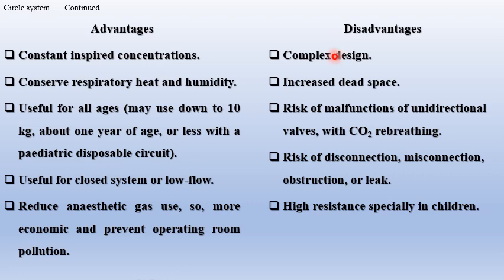Regarding disadvantages, it is a complex design with risk of malfunctions of unidirectional valves with carbon dioxide rebreathing and with increased dead space. Also, because of this complex design, there is risk of disconnection, risk of misconnection, obstruction, or leak. It can be used in children, but high resistance.